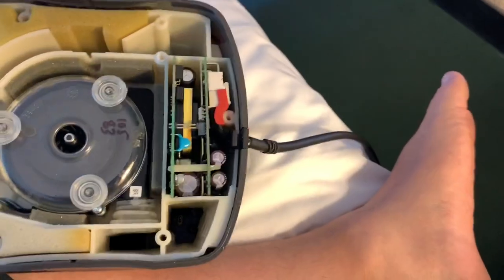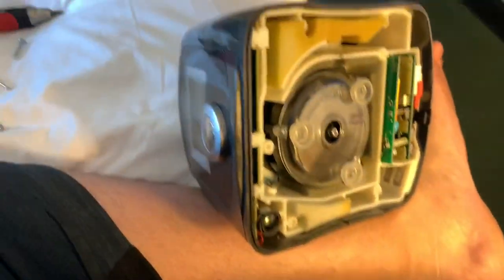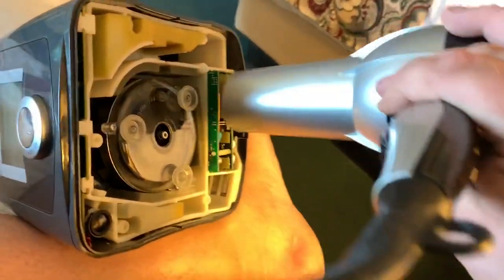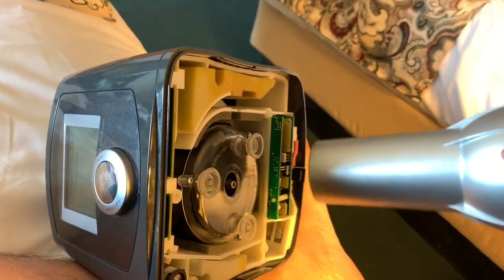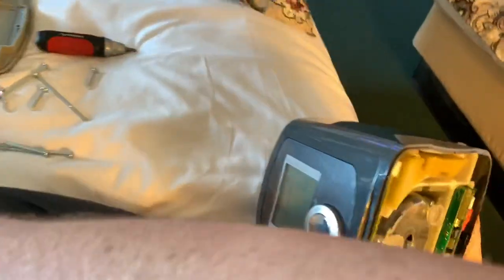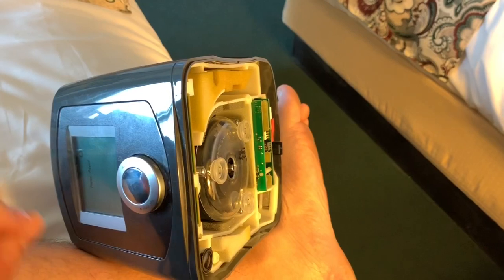What I did — and be careful if you have this plugged in, you don't want to get shocked — I laid it on its side. Took my hair dryer and put it on low, held it about six inches or so from these boards, and just slowly moved the fan back and forth, heating up these boards. I don't know if there's moisture, an issue with the capacitor, or what, but for some reason those boards need to be heated up and dry. I do that for about five or ten minutes, and as I'm doing that, I'm watching the screen because once that board is ready, all of a sudden this screen will just turn on.